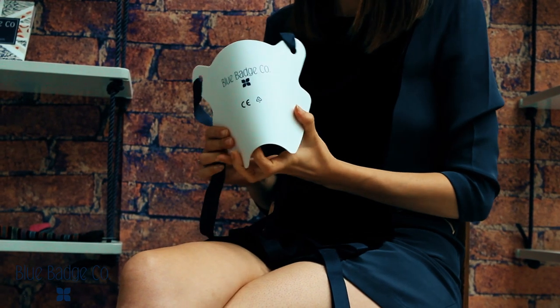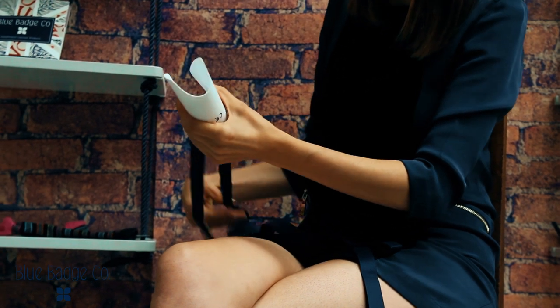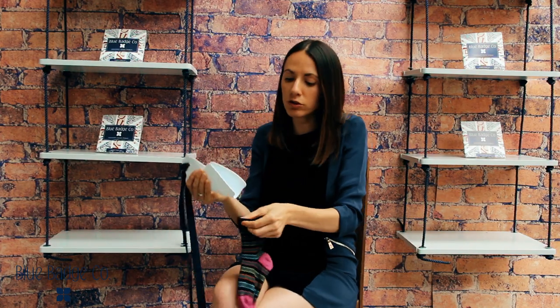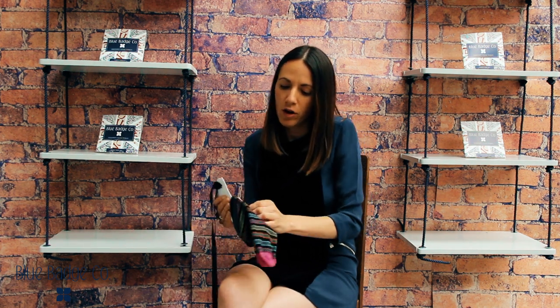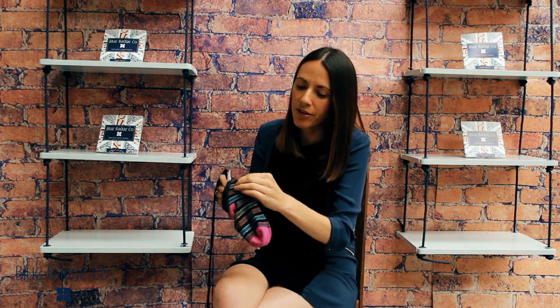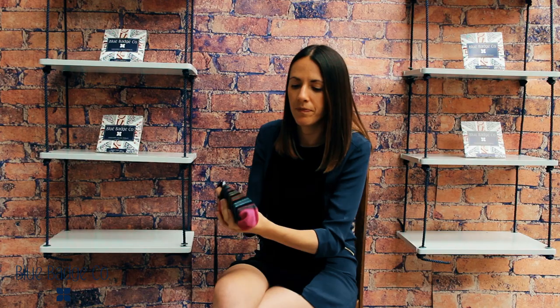You simply get the sock aid with the logo face downwards and bend it in half like so. You then take your sock and feed the sock aid into the sock, pushing it all the way up past the heel and down to the toe.